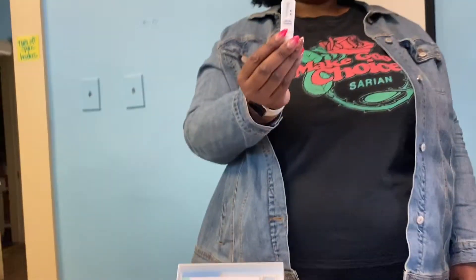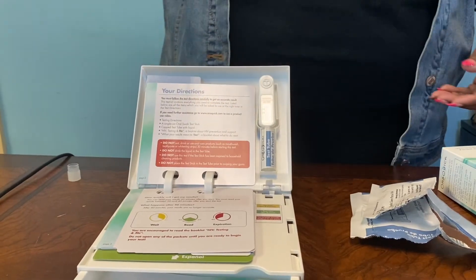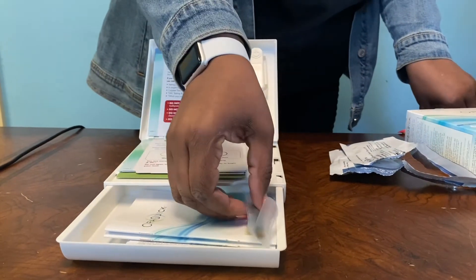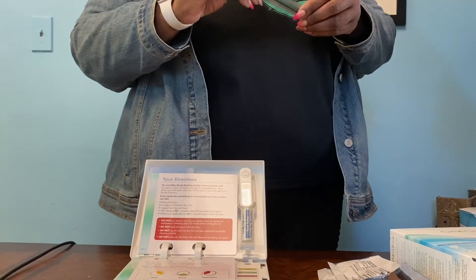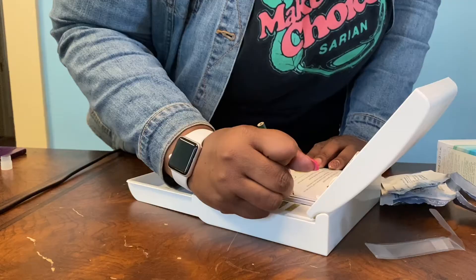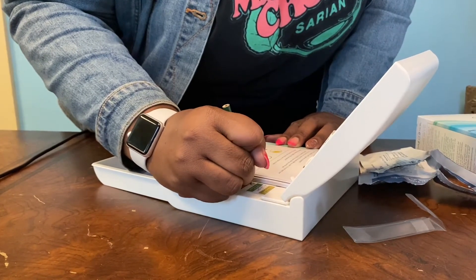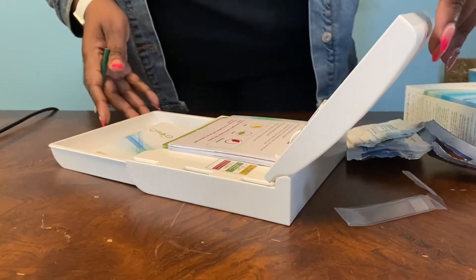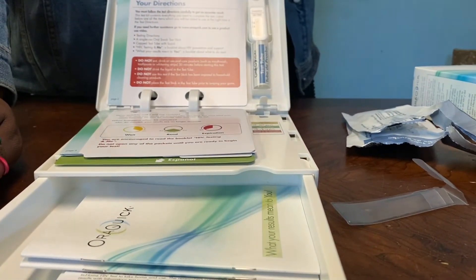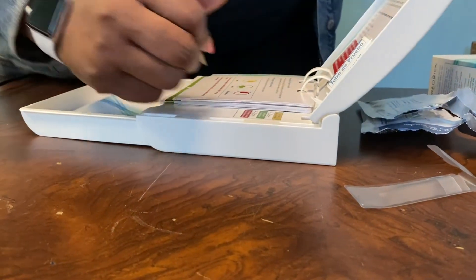Now put the test stick directly into the test tube — flat pad first, window facing you. Don't take the test stick out of the test tube or your results will be wrong. Inside the drawer you'll find a pencil. Use it to write down the start time of your test. You're also going to write down 20 minutes from the start time — that's the time when your test will be finished. Then write down the time 40 minutes from the start time. This is your expiration time. After 40 minutes, the lines on the test stick may be overdeveloped and your results will not be accurate.